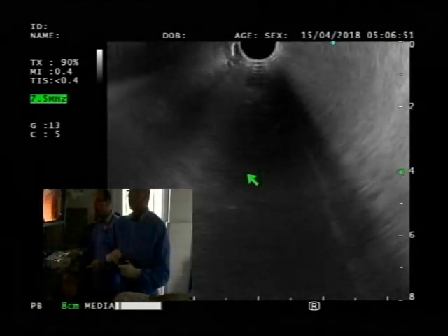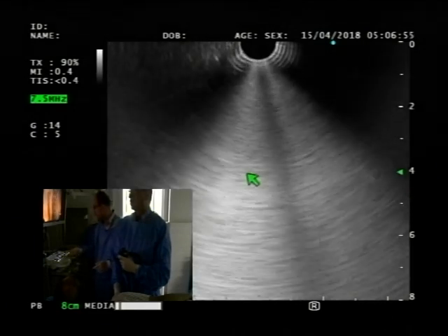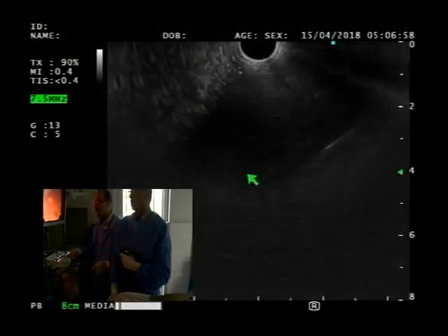And we do the same, right? We get a very bleached image. Okay, so we may have to lower the gain.